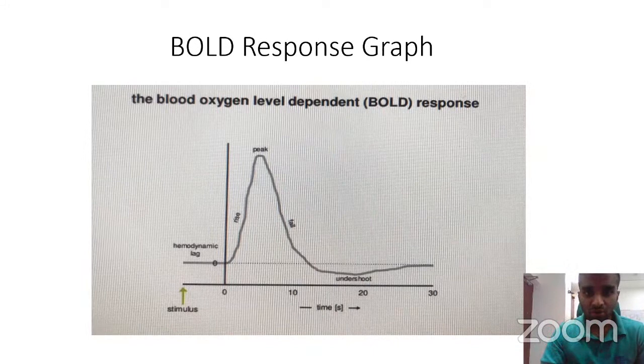When the perfusion of oxygenated blood to that region increases, oxygen content increases. That is described in the form of a graph here. See, it has reached its ultimate. When someone is engaged in that activity, that region is getting more and more oxygenated blood. That is what this peak indicates. And when you stop doing that activity, the graph comes back.